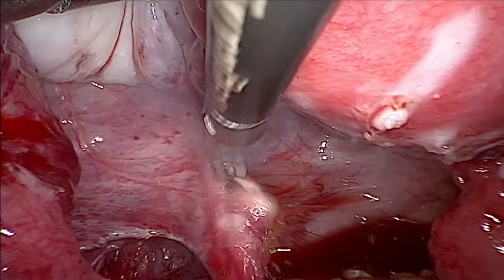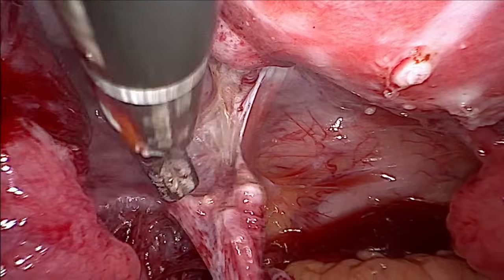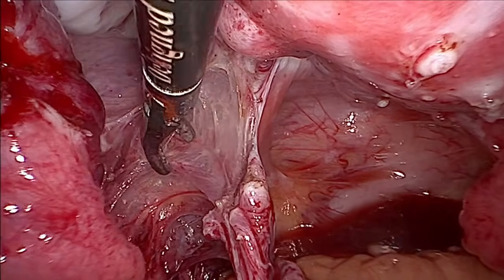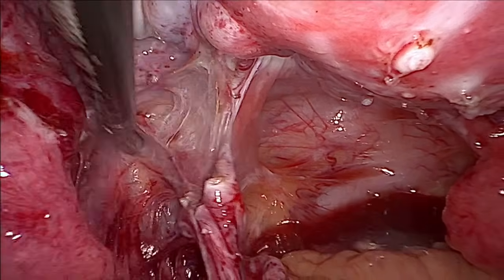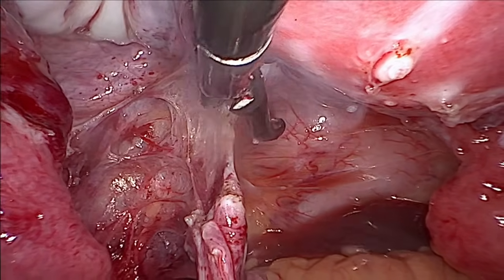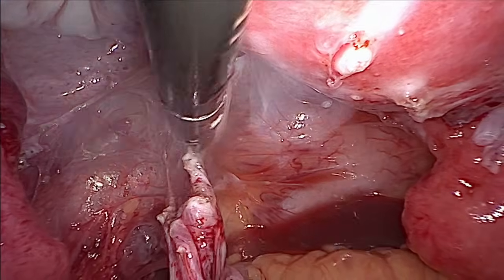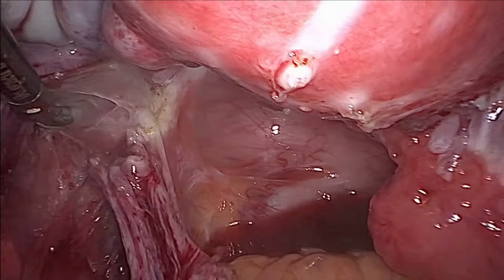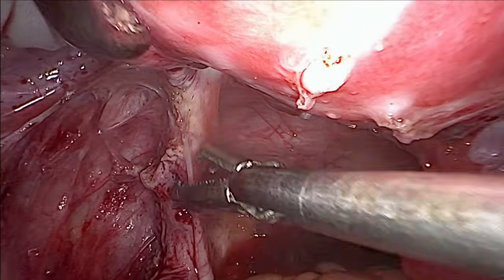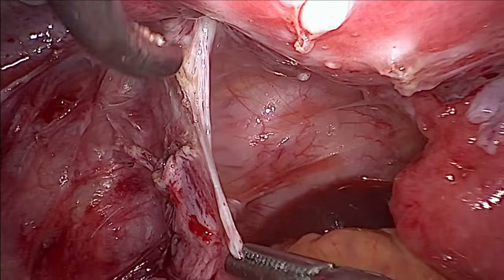You can see I am pulling the peritoneum cranially. Be careful of any important structures. This is the pararectal space.